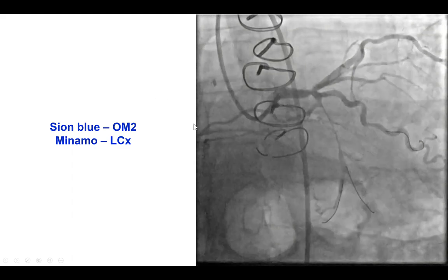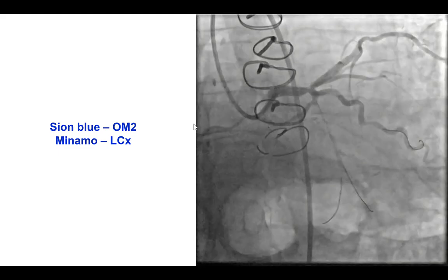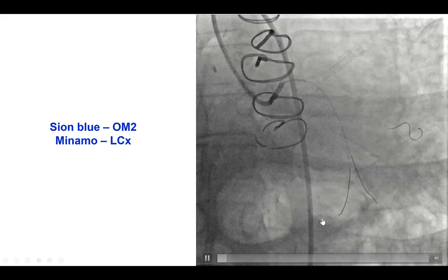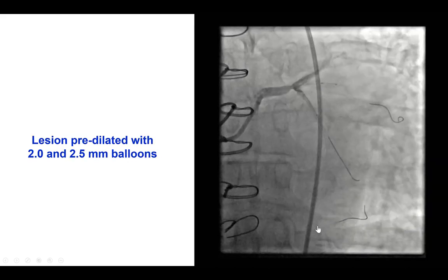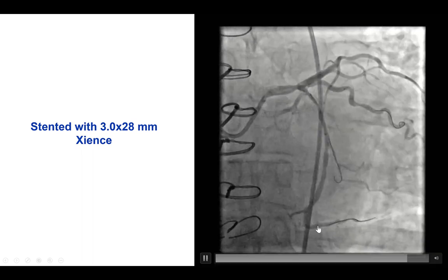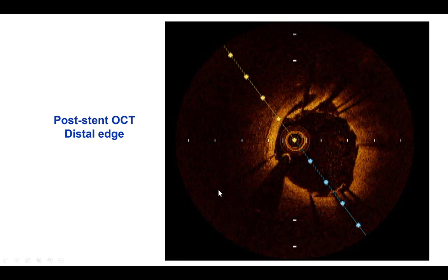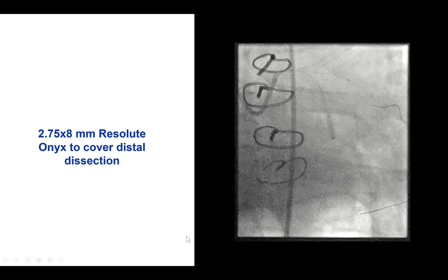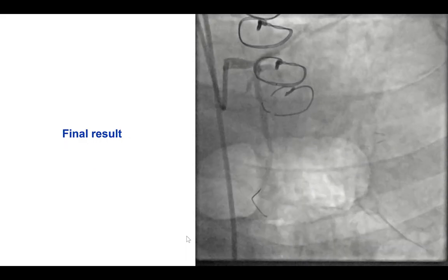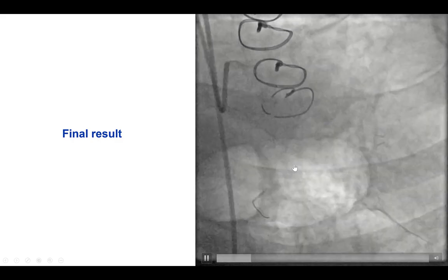We were able, using the Recross, to actually re-enter into the distal true lumen. We then switched to workhorse guide wires in both branches distally, and then proceeded with balloon angioplasty and stenting all the way to the proximal circumflex. We did perform optical coherence tomography showing a dissection, and that is why we placed an additional drug-eluting stent. That provided a nice final result with good flow into this dominant left circumflex vessel.